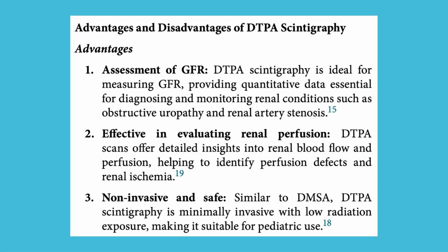Advantages and disadvantages of DTPA scintigraphy. Advantages. 1. Assessment of GFR. DTPA scintigraphy is ideal for measuring GFR, providing quantitative data essential for diagnosing and monitoring renal conditions such as obstructive uropathy and renal artery stenosis.